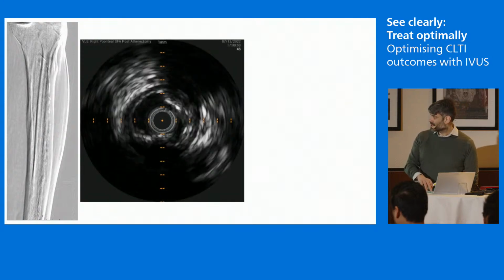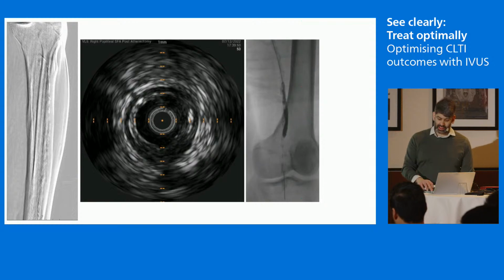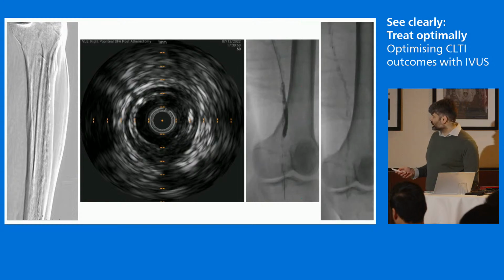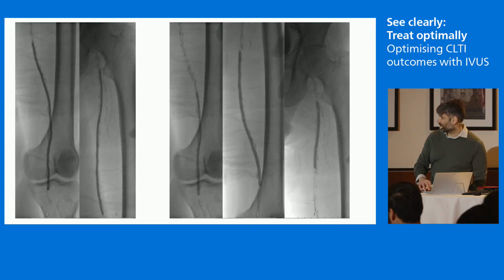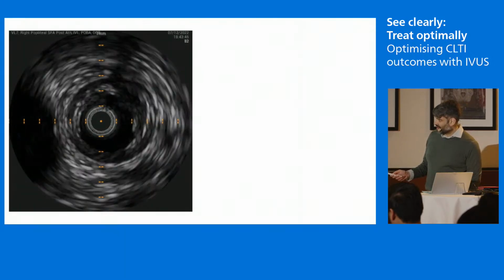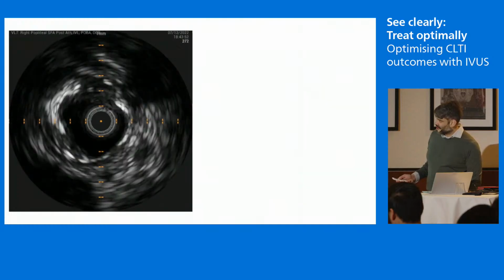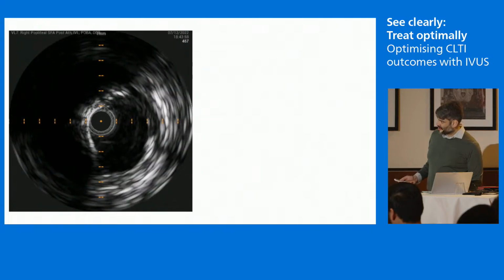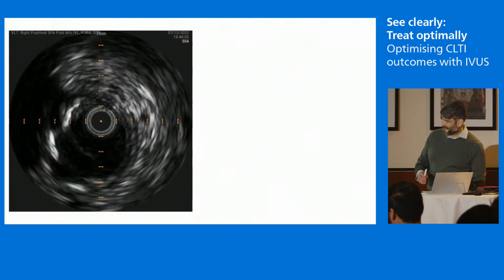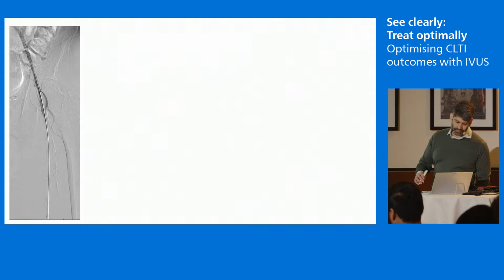continues to smoke. So at this point, we made the decision to open a second vessel prep device and use IVL to treat that calcium. And we had a good result there. And plain balloon angioplasty, drug-coated balloon angioplasty out to size, and now this is the IVUS again. Much better, apart from in one location where it's not completely perfect, there is one particular area where we can see significant stenosis. So we went back and hit that again with a high-pressure balloon angioplasty at that location.